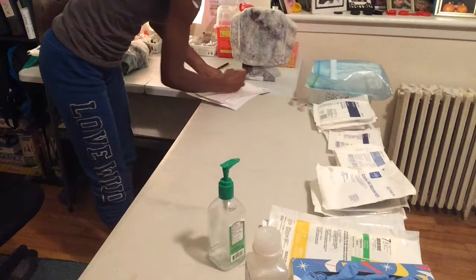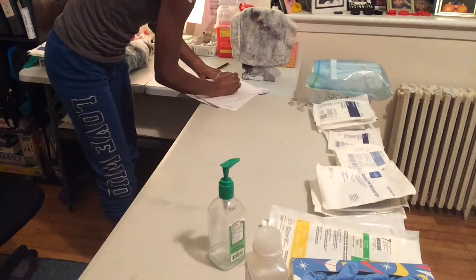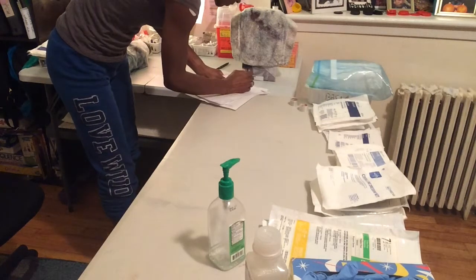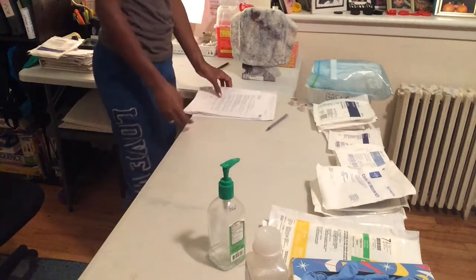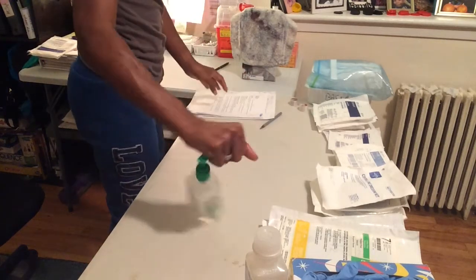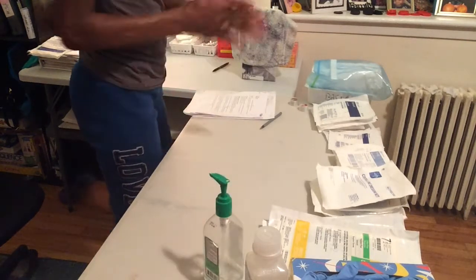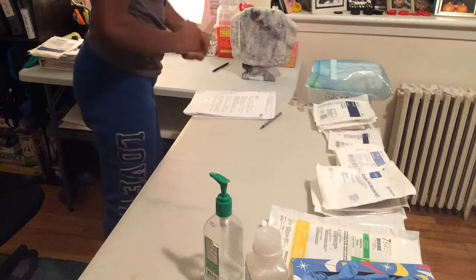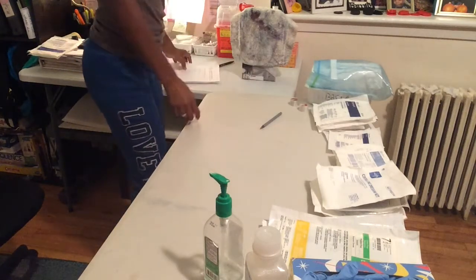Now I'm going to go ahead and identify my patient against two of the three identifiers: name, date of birth, or the medical record number. Now I am gelling my hands again and I'm going to gather and organize my supplies.